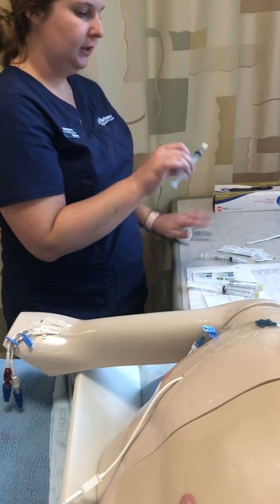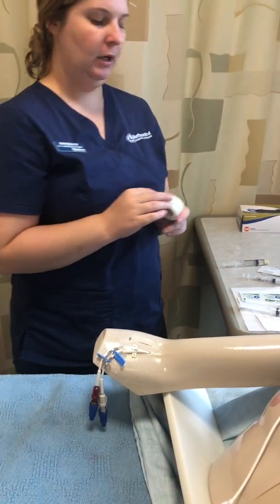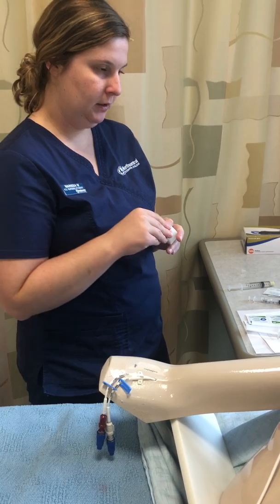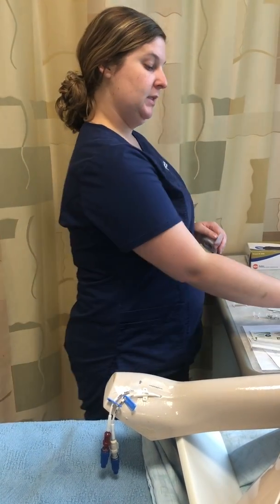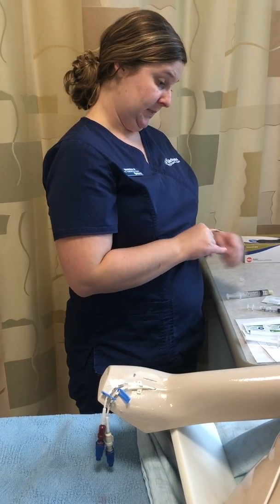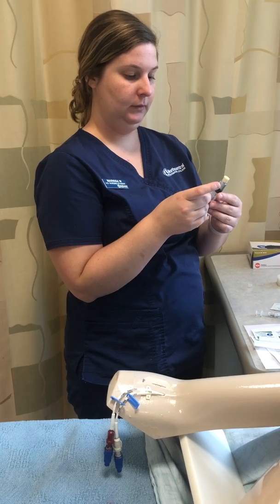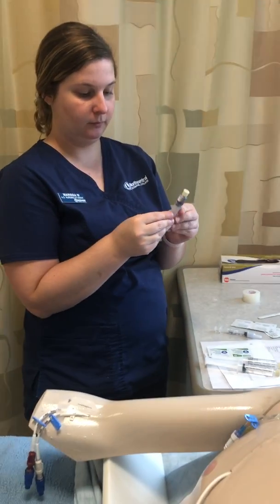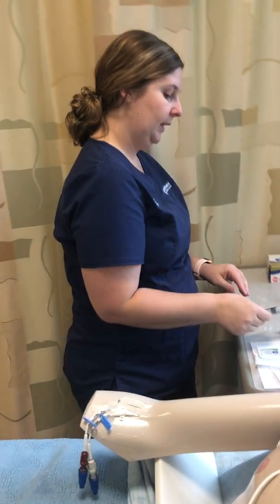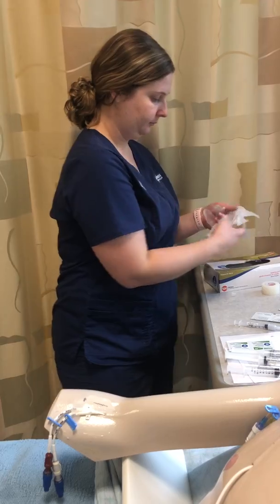Oh, before I do that, actually, now that I have this diluted, to make sure I know what one is diluted, I'm going to take my tape and make a label out of it here. I'm going to label that it's 1 milligram of lorazepam in 1.5 mLs. It is the dose, and that it is in normal saline. So I'm going to go ahead and label that. Then I'm going to go ahead and put my gloves on here.